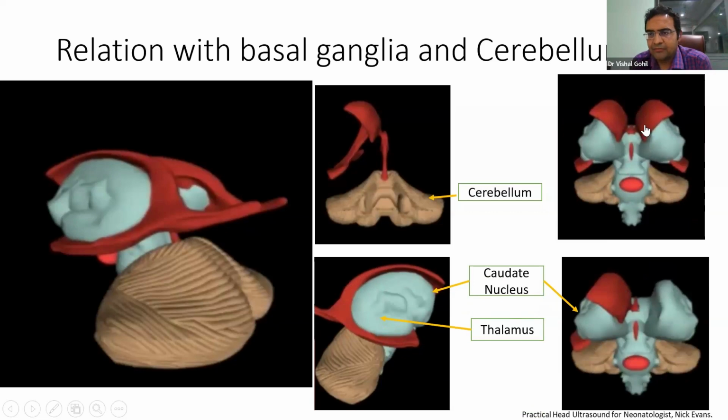Now I add both lateral ventricles over here. If you see, okay, so these are both our frontal horns. So anyone from the delegates, can you say what would be in between that one? Anyone? You can put it on the chat box.